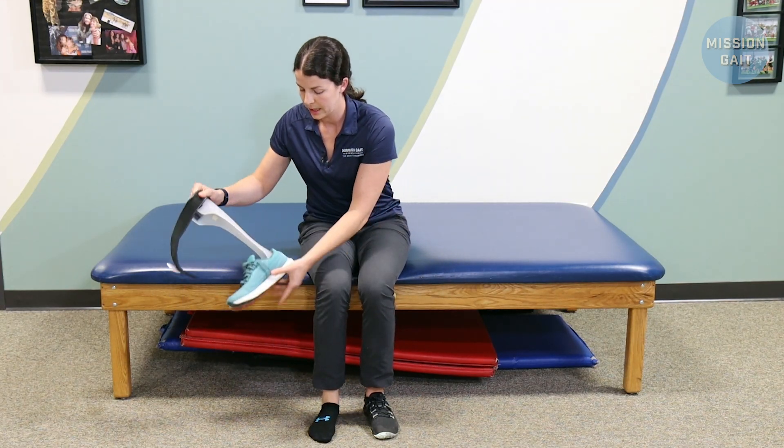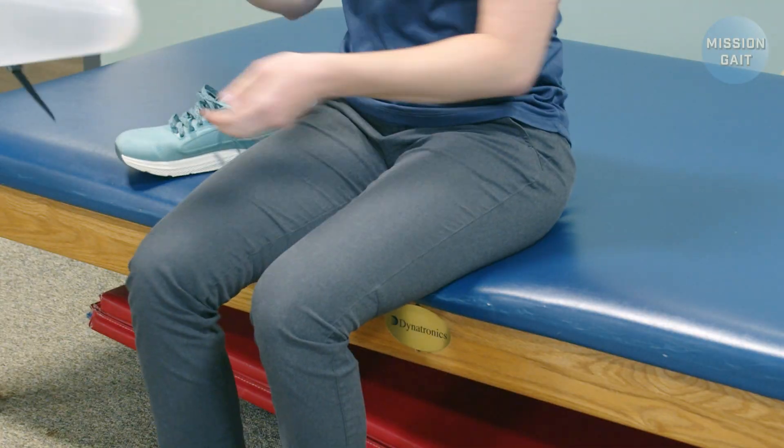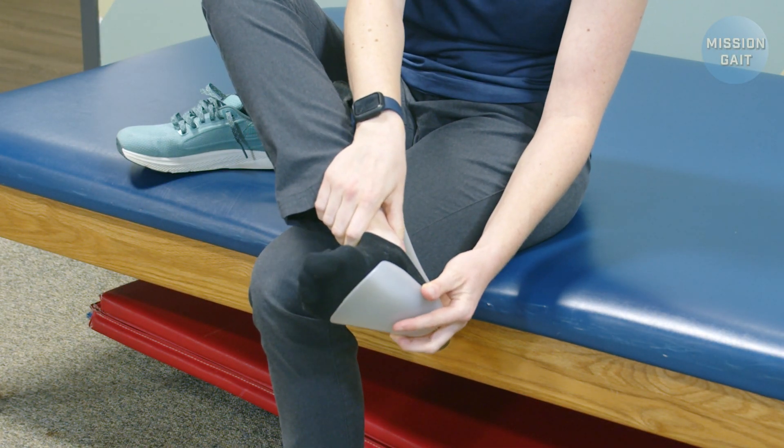When you are putting the brace on, typically you'll want to put the heel in first and then slide the heel back.